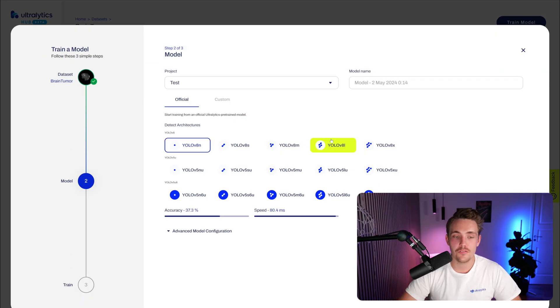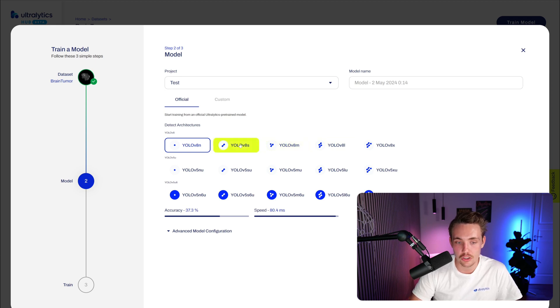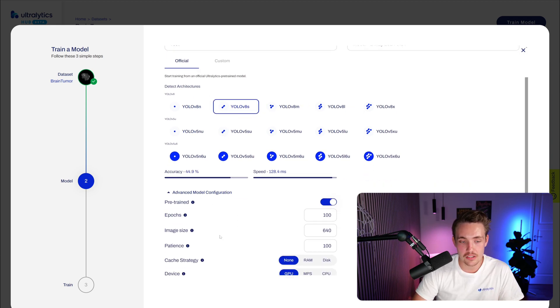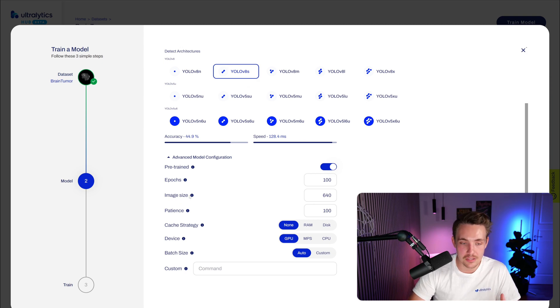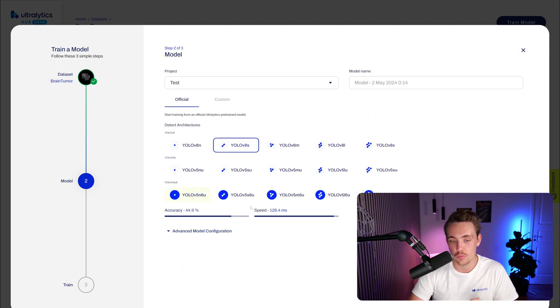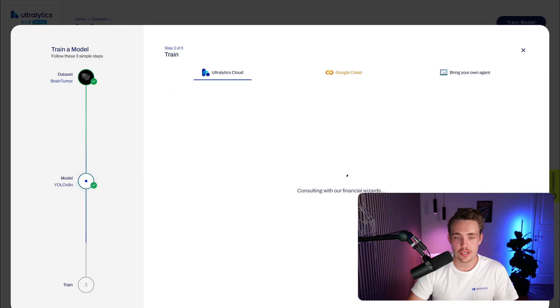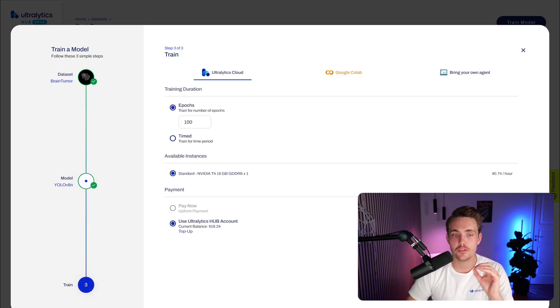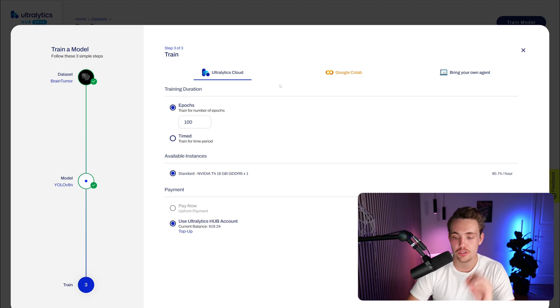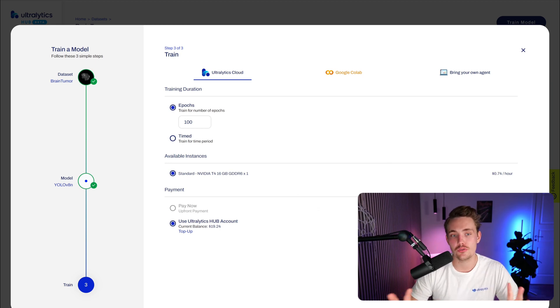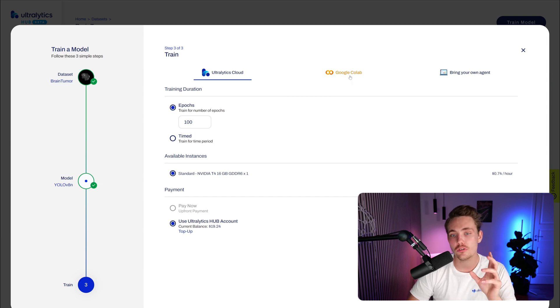We don't have to do any code, only a few clicks and we're now training a YOLO V8 model. Let's just go with a small model. We can get some advanced model configuration with the number of epochs, patience, image size and so on that we want to use. Let's just go with default ones. Now we can hit continue here and it should redirect us to the training. We have the option for using the Ultralytics cloud - no code at all. We just need to hit start training and it will use the cloud tool and feature from Ultralytics inside the hub.